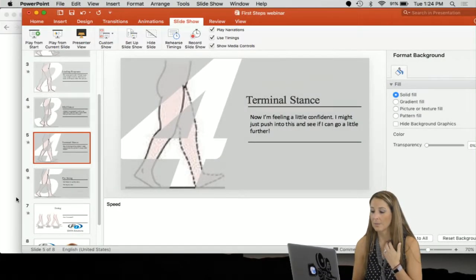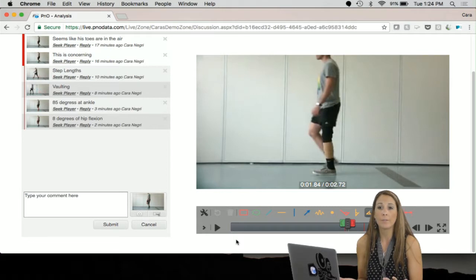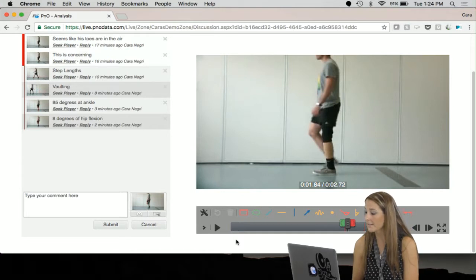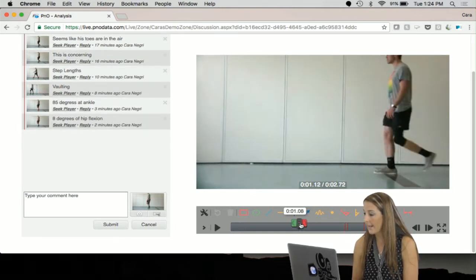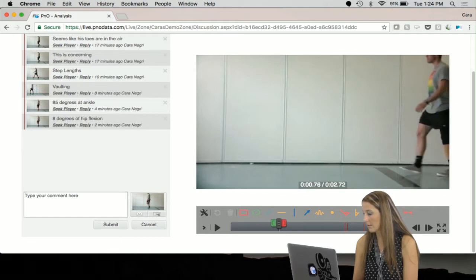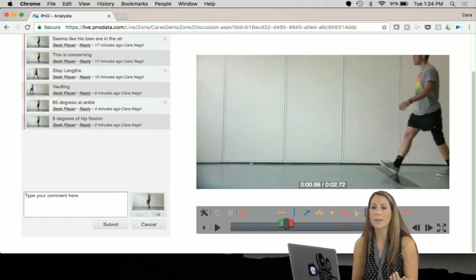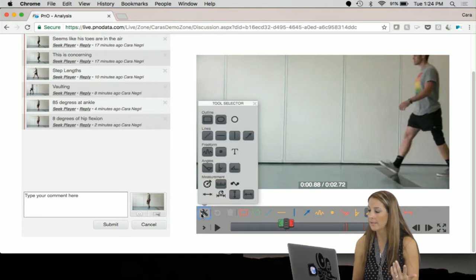So speed measurements can be used to measure how fast somebody is walking, and those can be a determinant of a person's safety, of their risk of fall, things like that. So we'll go ahead and go back a little bit, and again we're going to start to look at when the patient comes into the screen and as soon as he hits the floor. We've already calibrated our screen, so we don't have to do it again.